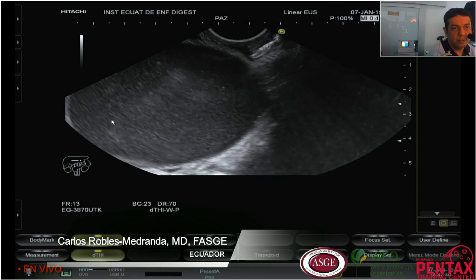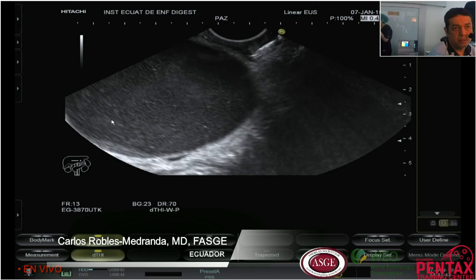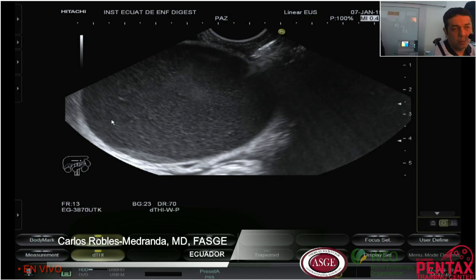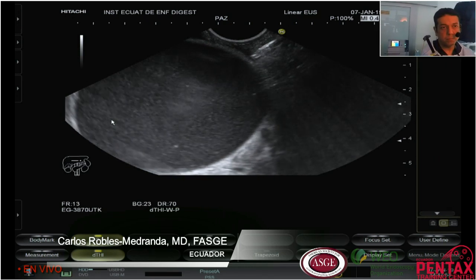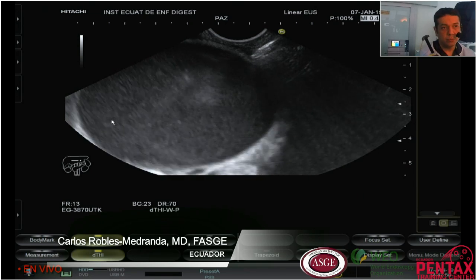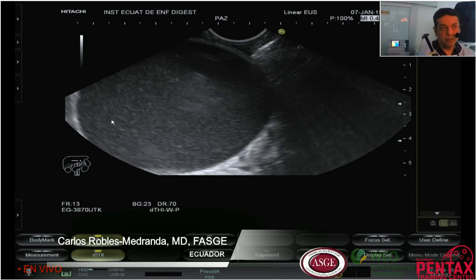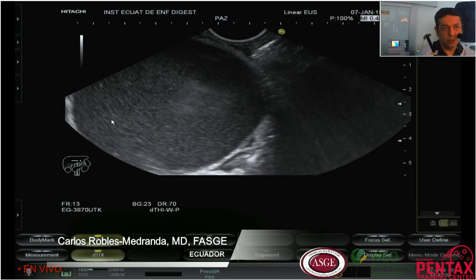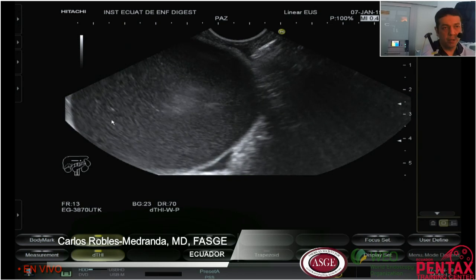It has at the tip of the device an electrocautery cystostome, so we can do all the drainage in a single step. As a tip, here I am not very far from my gallbladder, so I am sure that I can do it in a single step.